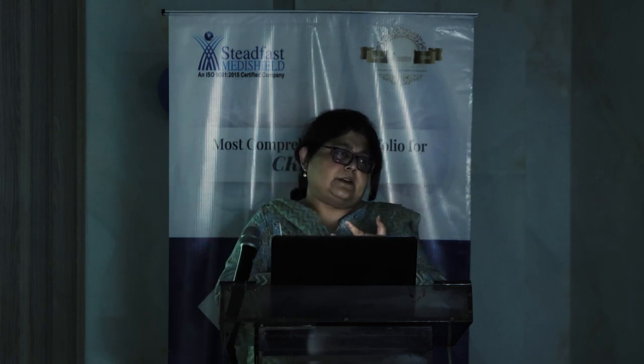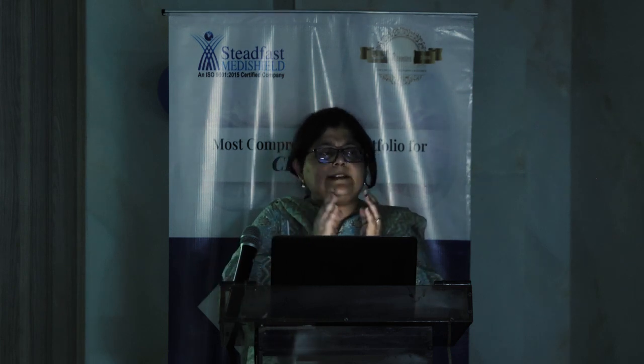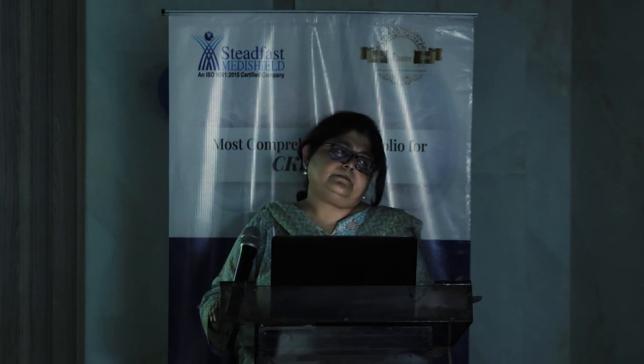So in situations where GFR as a value is very essential, like for instance a donor evaluation, or a small child who has a single kidney where you're trying to assess the sequential GFR, or in a patient who is not of a standard size, a very small patient or a very fat patient, you must do a blood sample method, because that is a more accurate way of assessing GFR.